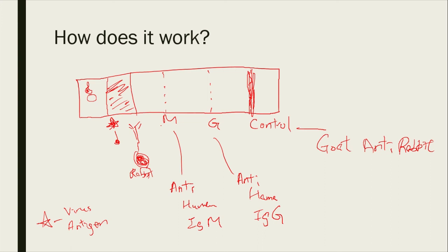Now, looking at a clinical sample, if a patient provides you with a drop of blood that contains IgG against this antigen, what happens is that your IgG will bind to your antigens, which carry gold. Now it will move along in a lateral flow fashion, due to capillary action.